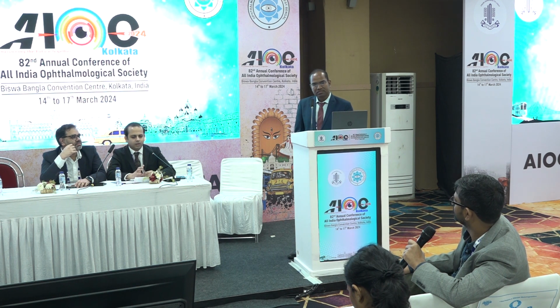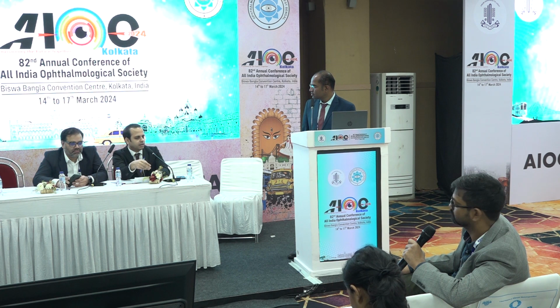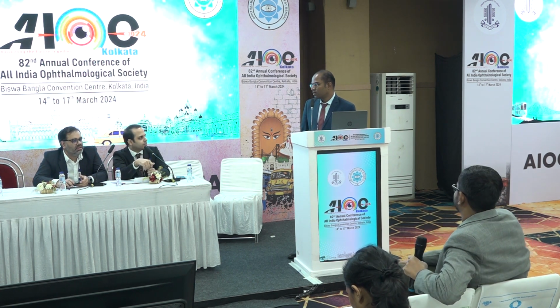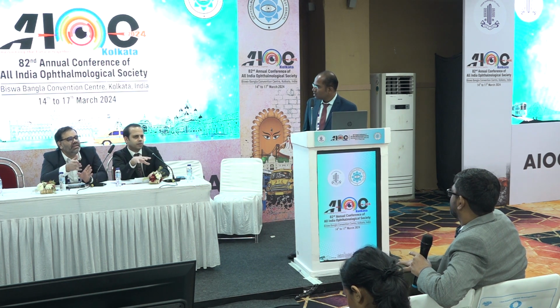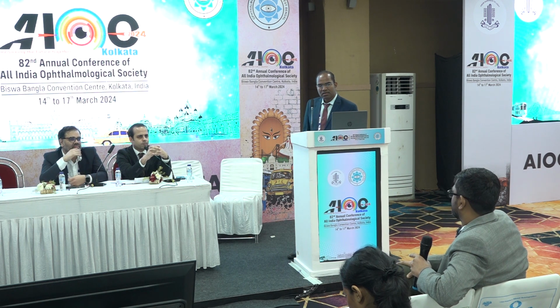Yes. Another thing I have tried is, if there is a smaller piece, I levitate it and then eat it up with the phaco. You can do that in this case, with some theoretical traction possibly still happening. I am talking about after doing the vitrectomy, of course. Rather than making a large tunnel, I can share one personal feeling.